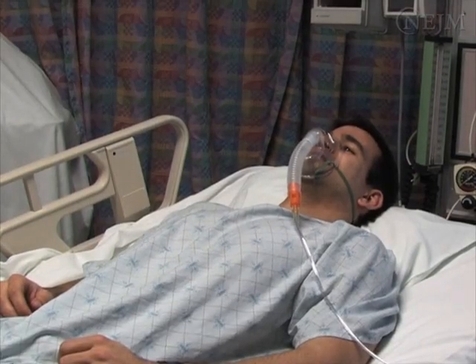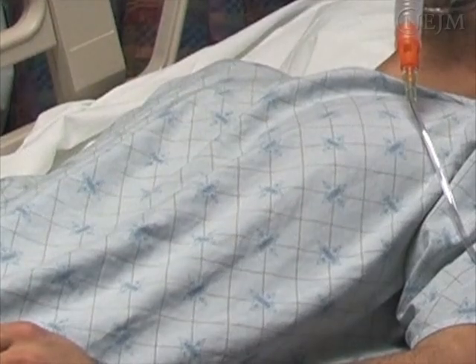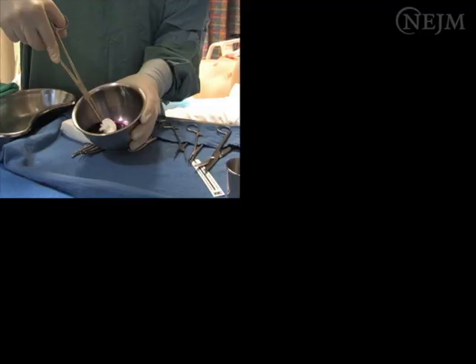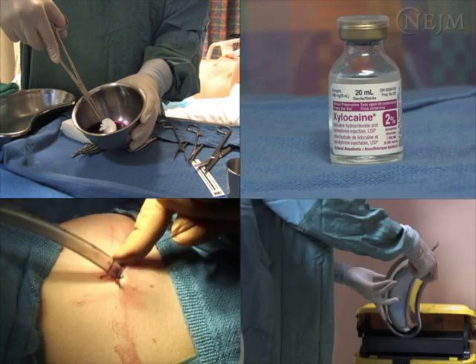The insertion of a pleural chest tube is often done in a setting where immediate action is required. Nonetheless, adherence to sterility, analgesia, sound technique, and safety are always warranted.